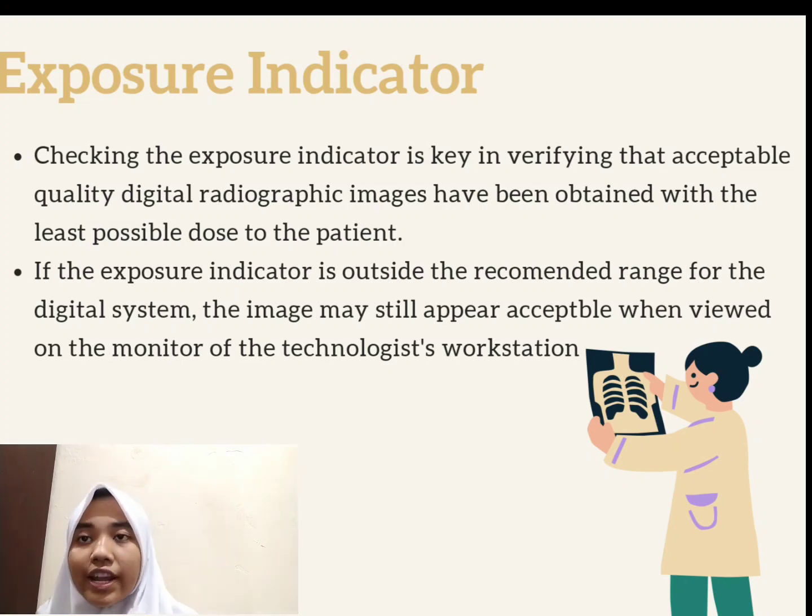If the exposure indicator is outside the recommended range for the digital system, the image may still appear acceptable when viewed on the monitor of the technologist's workstation. The monitor the technologist uses to view the image typically provides lower resolution than is provided by the radiologist's reporting workstation.